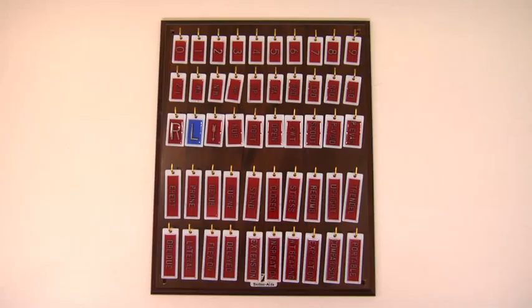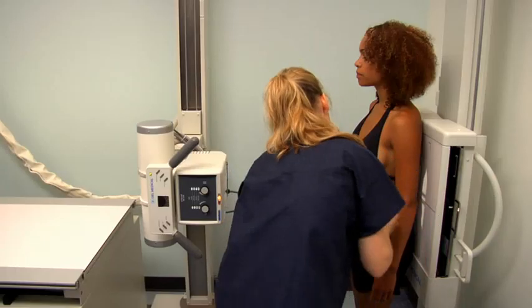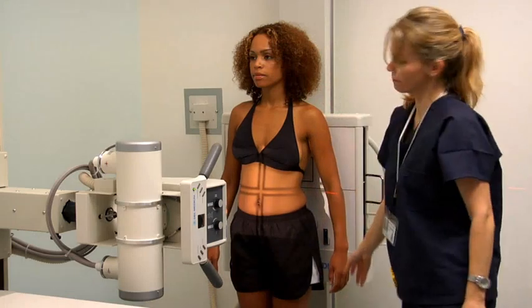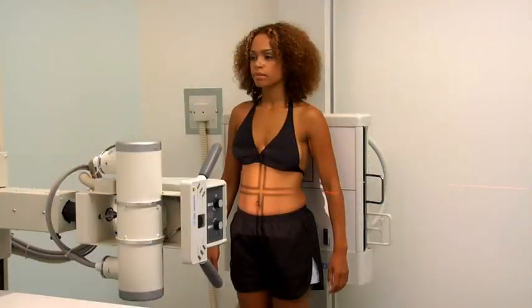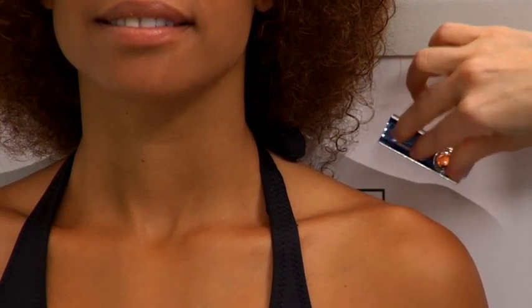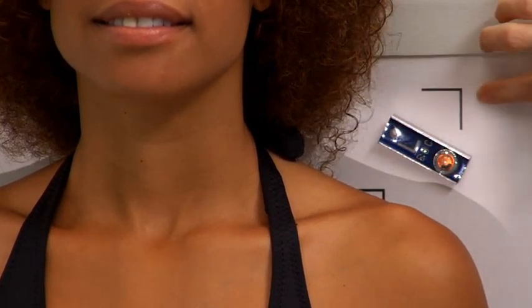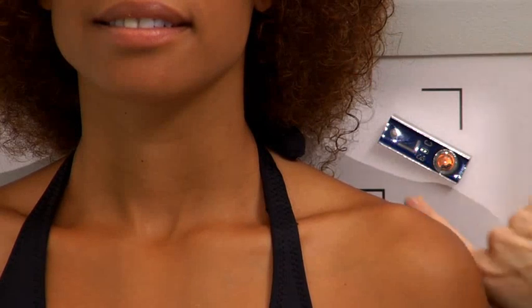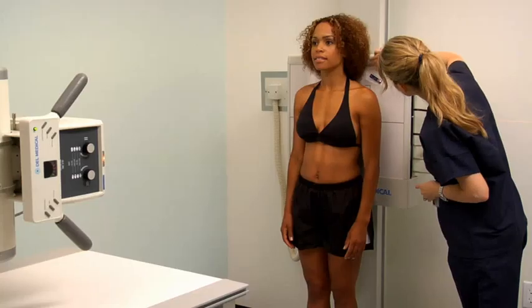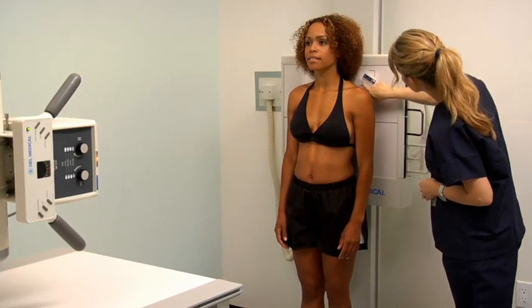Radio-opaque markers must be placed just within the field of collimation so that they are exposed and included in the final image. Markers should not superimpose on any anatomy. The R for right or L for left marker indicates the orientation of the patient for the projection. The markers are placed directly on the image receptor on the inside of the lateral portion of the collimated border, on the side being identified.